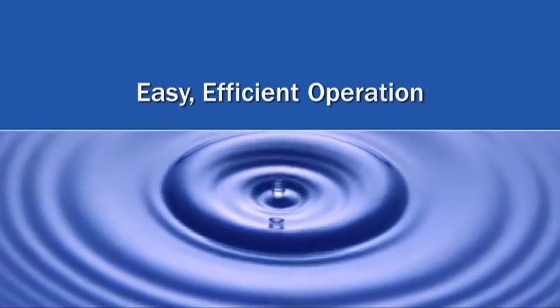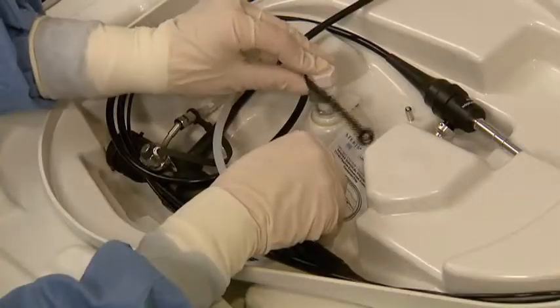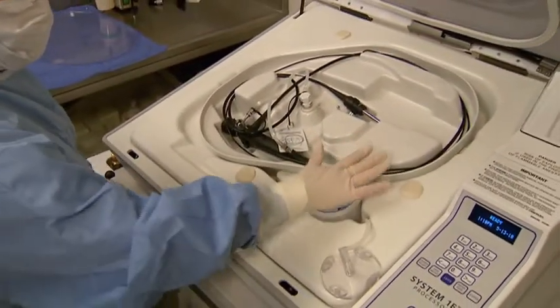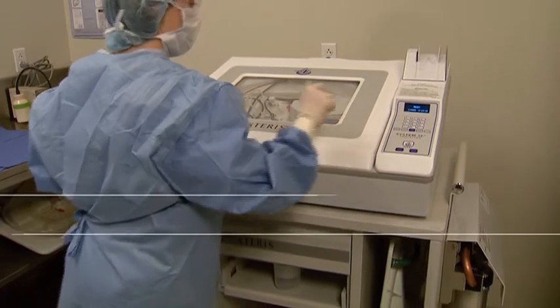The System 1E is easy to use and extremely efficient. Simply insert the device into the tray, attach the quick connects, position the single-use S40 Sterile Concentrate Cup into the tray, and start the cycle.